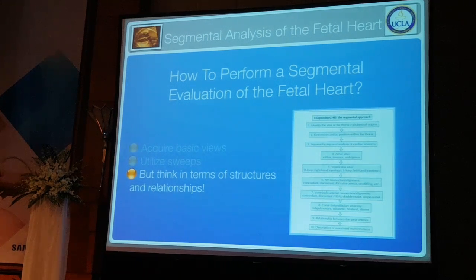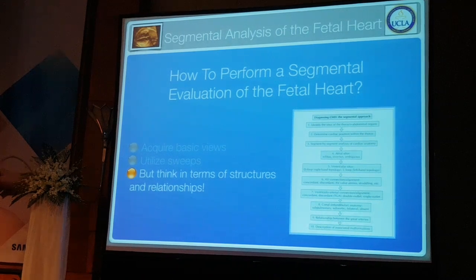Because when I'm scanning, often I need several different four-chamber views to see the four-chamber. It's not just one view, it's often multiple views. And you want to think in terms of relationships, meaning how is one part of the heart connected to the next, and for that you often need to sweep.